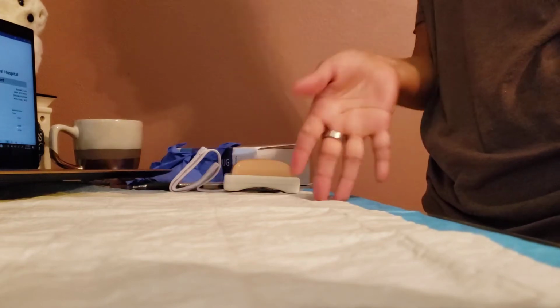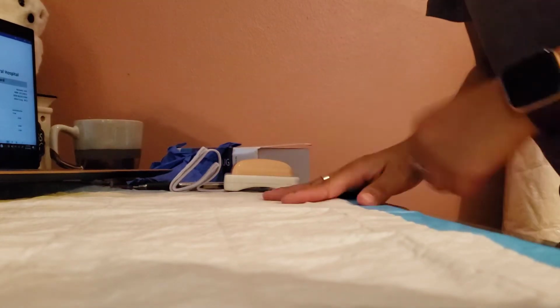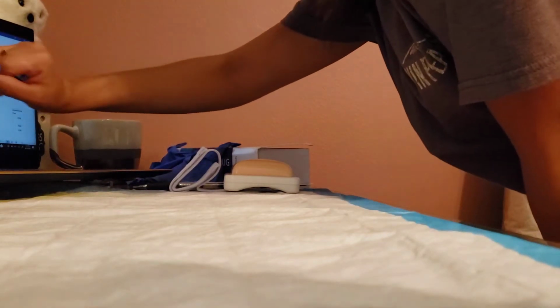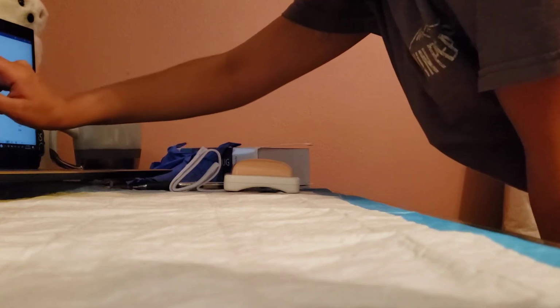Hi. So today I'm going to be doing my injection video. I'm going to go ahead and get started, and I'm going to want to verify my physician order to my MAR. So I have Mr. Jack Buzzard, 62019XX, no known allergies.